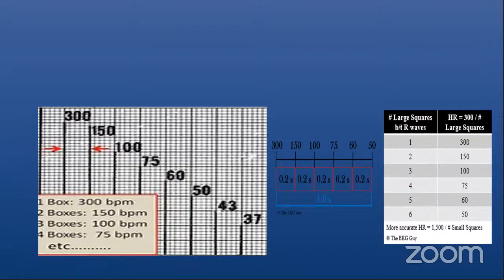That is 100% true. That's the main thing. Well, one is the rate, obviously. But at the same time, with that ECG, some sort of a rhythm strip, you will know whether this is going to be an arrhythmia or something else.